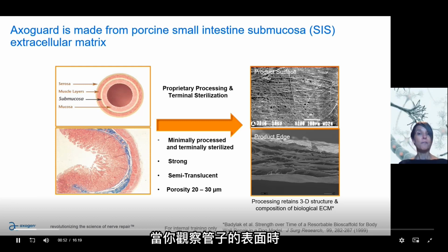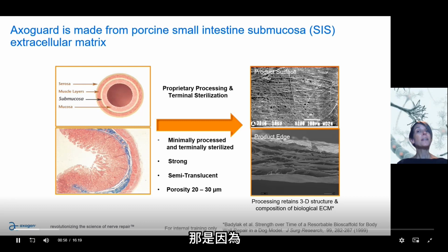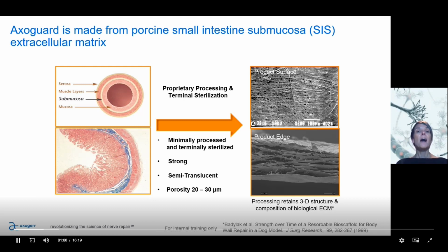When you're looking at the surface of the tube, it's not porous like the edge is, and that's because we don't want scar tissue to be able to infiltrate into that tube. So it's important to remember that when we talk about that porosity, we're really talking about it from the product edge.